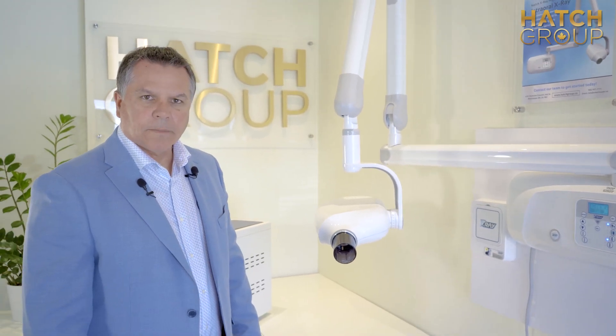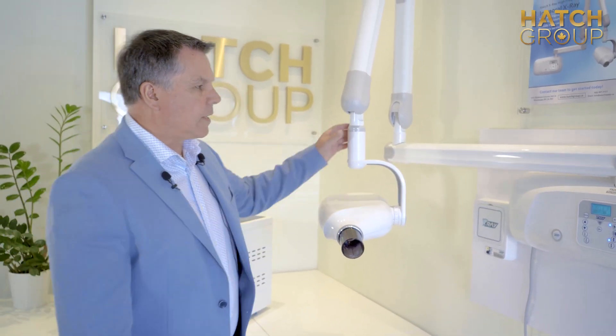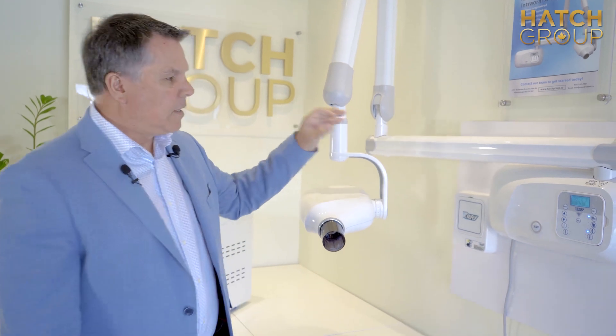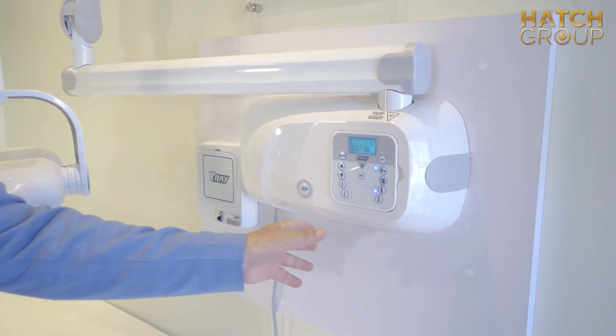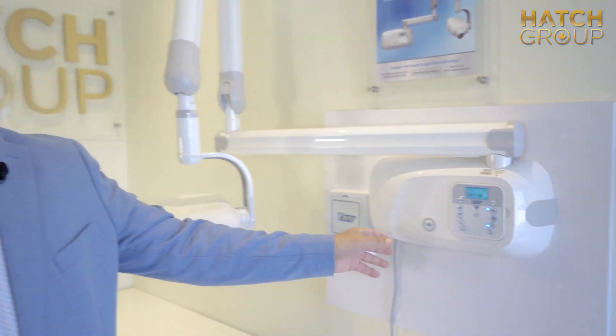I'd like to introduce you to the Hatch X-ray. One of the nice exciting features about the X-ray is it can be mounted horizontally or vertically with the same unit. You do not have to change units.